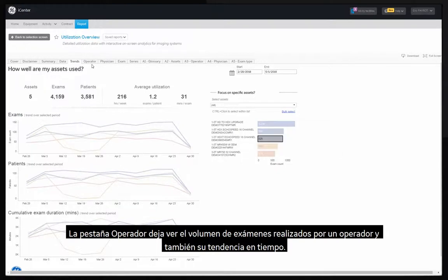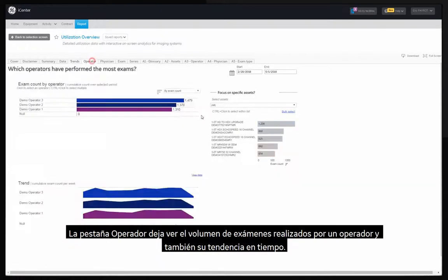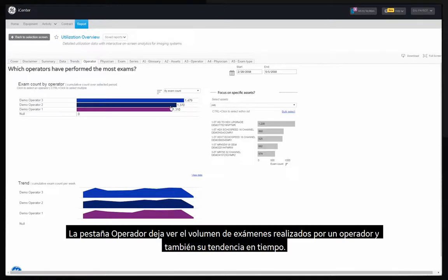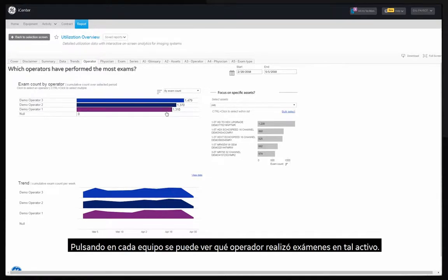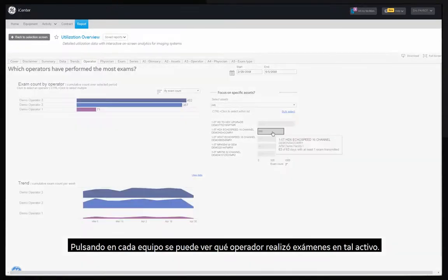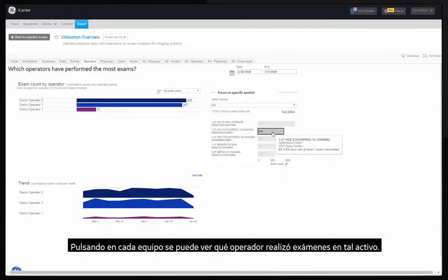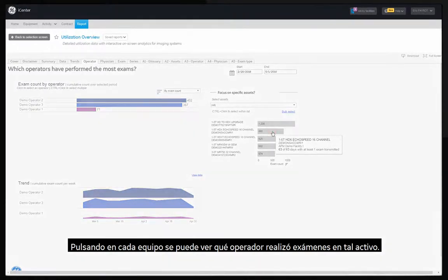The operator tab allows to see the volume of exams performed by an operator as well as trend in time. By clicking on each equipment you can view which operator performed exams on that asset.